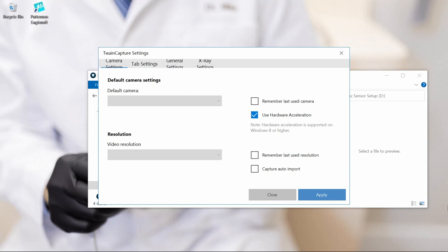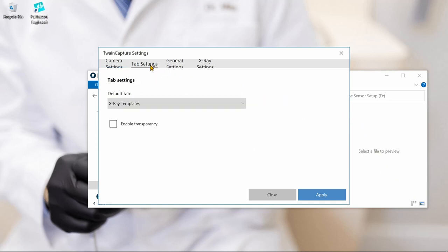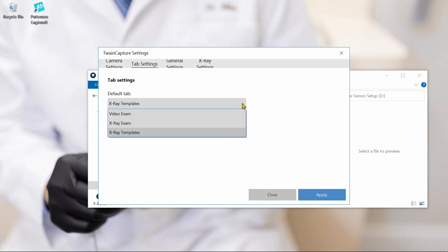Let's configure the Blue Sensor for use in Patterson EagleSoft. First, we'll go to the Tab Settings and set the default tab to X-Ray Templates.